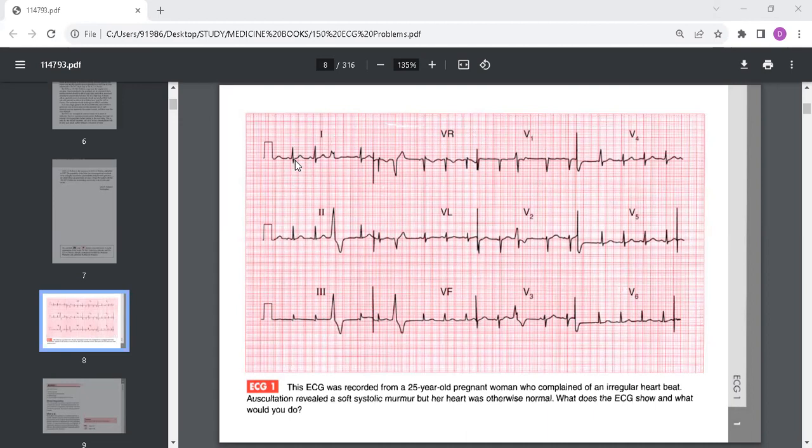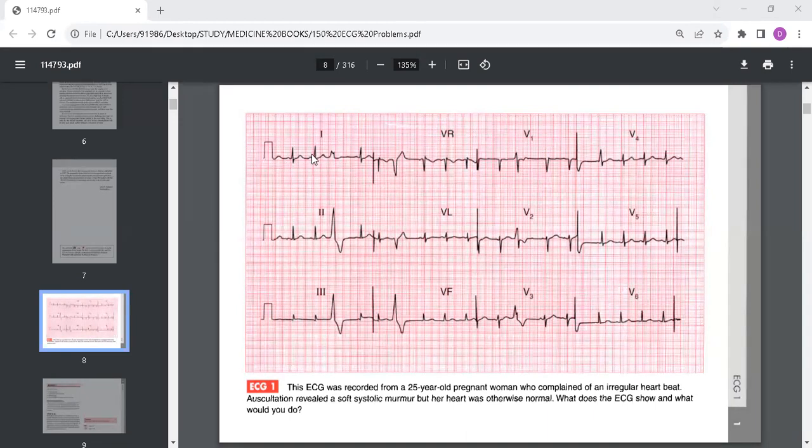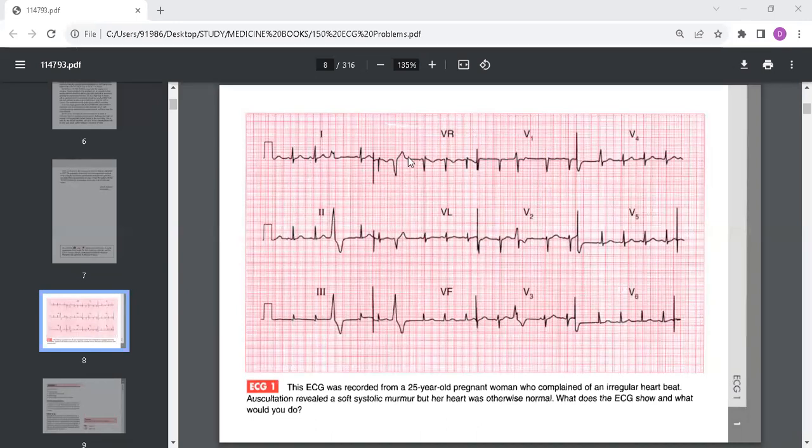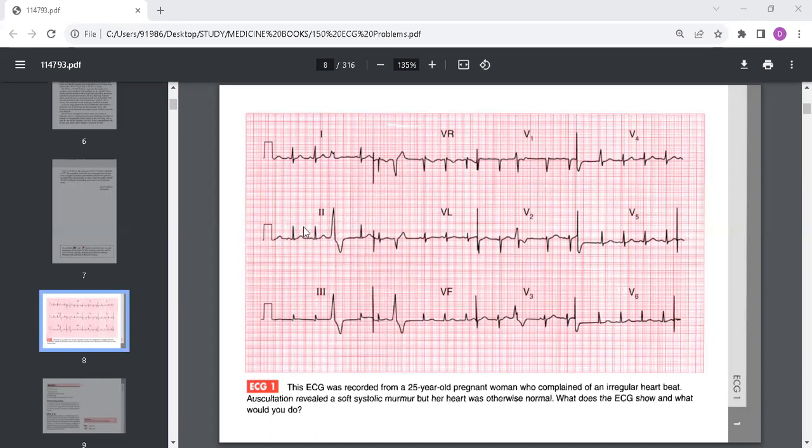The rate is around 100 beats per minute. We can also observe some ventricular extrasystoles. The axis is normal, the QRS complexes are normal as are the T waves. The extrasystoles in this ECG are fairly frequent but the ECG is otherwise normal.